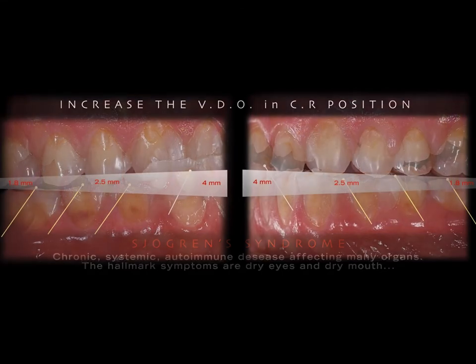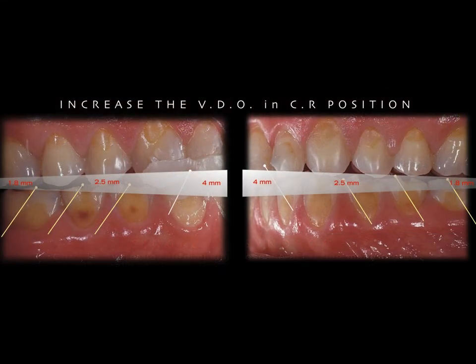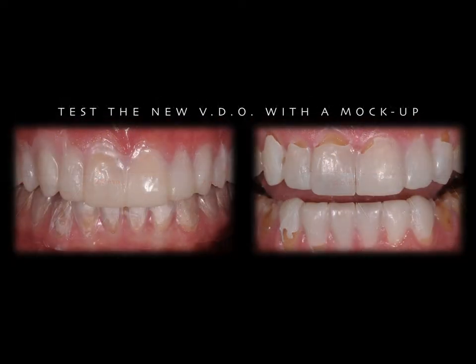But today, what we really like to do is to put the patient in centric relation position, increasing the vertical dimension in order to really minimize the invasiveness of our treatment, to be as less aggressive as possible. To test this new height between the two arches, we can have some mock-up that allows you to really certify that you can do it, and at the same time to show the patient how the aesthetic result that you can obtain at the end looks.